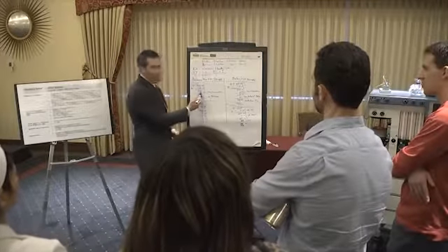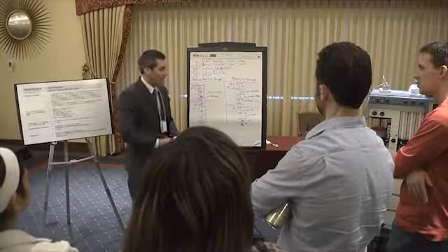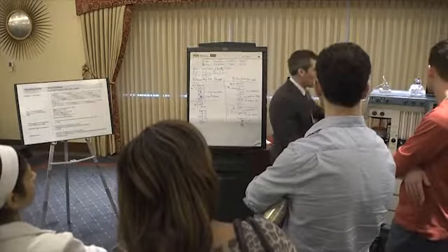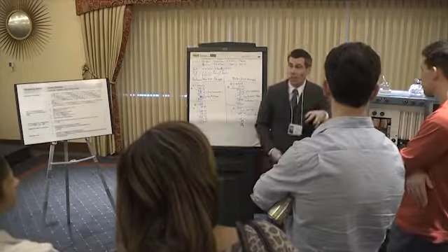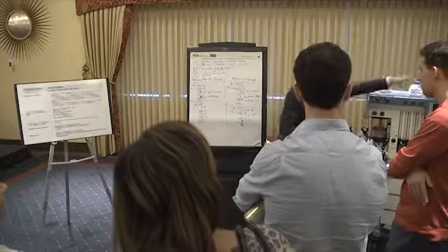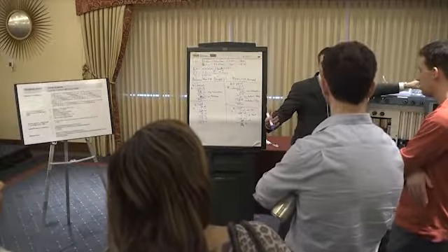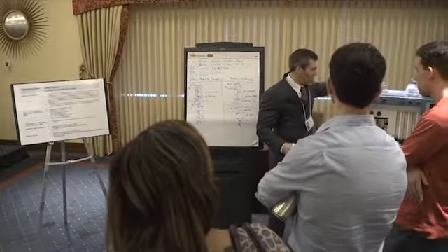So we lose 50 mLs to the circuit compliance, which gives us 816. Now, a fixed gas analyzer like this one, any machine that doesn't have an integrated gas analyzer, has a pump that's a constant draw. Regardless of whether your anesthesia machine is on or not, it's going to be pulling 150 to 200 mLs per minute constantly. External gas analyzer will then vent into the scavenger.